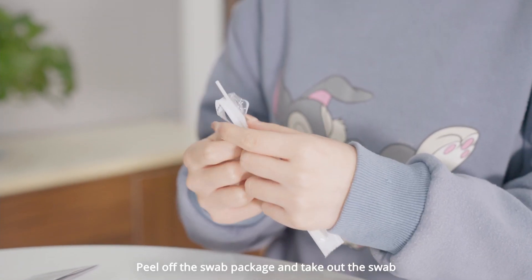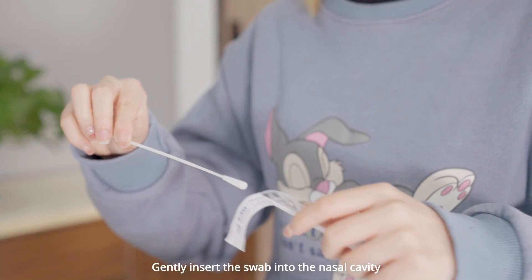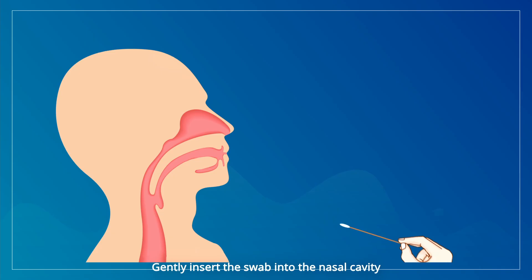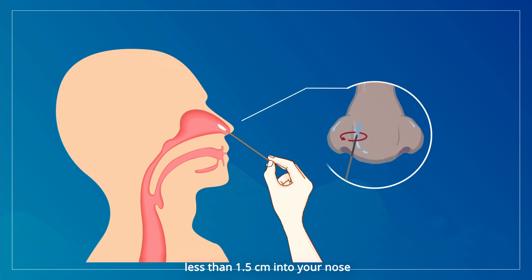Peel off the swab package and take out the swab. Gently insert the swab into the nasal cavity less than 1.5 cm into your nose.